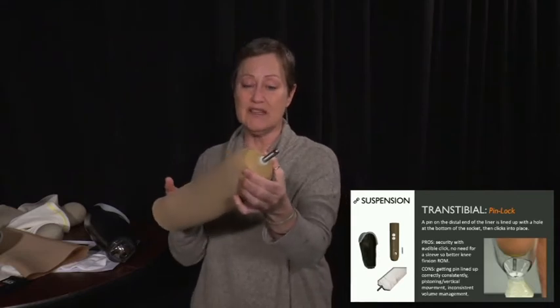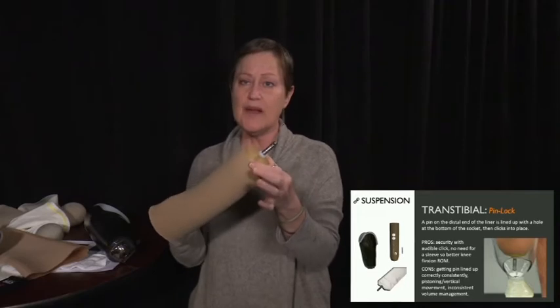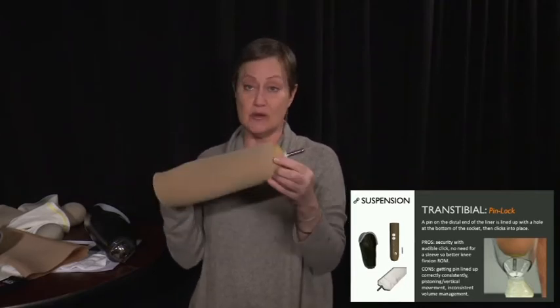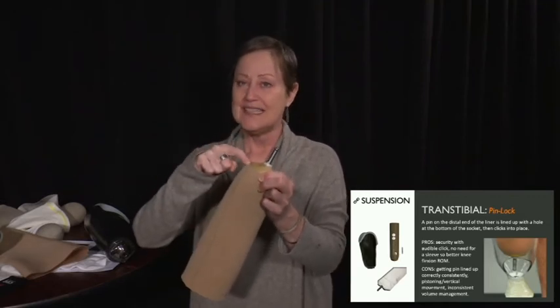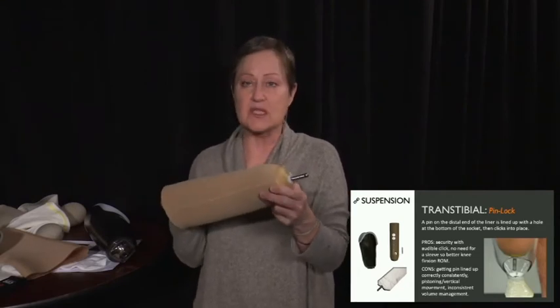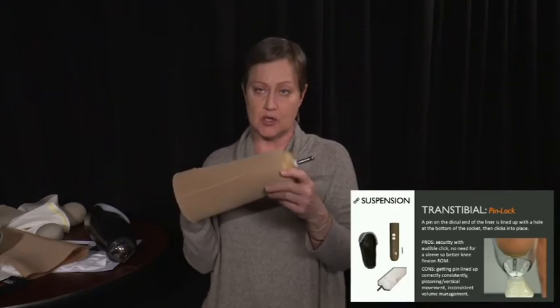It has this really rigid plastic umbrella. When the patient is donning this, they need to roll it, as I talked to you about, turning it inside out all the way to the umbrella, so that again we try to avoid any gaps, any areas where we're going to add increased pressure.